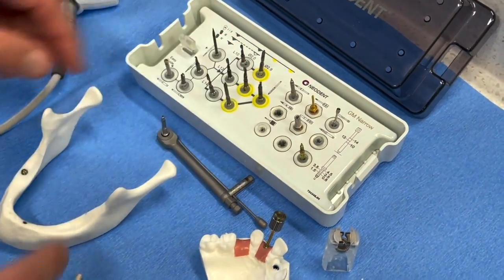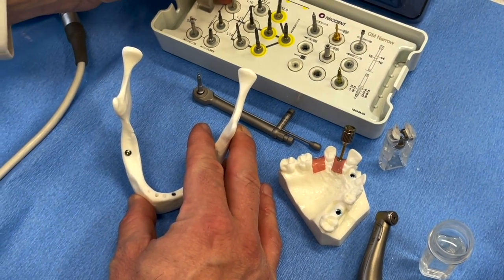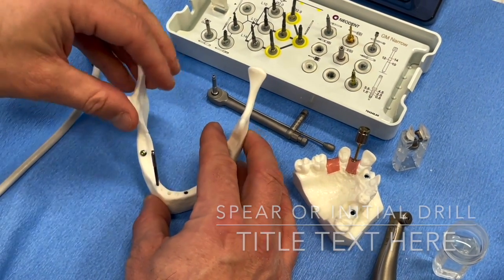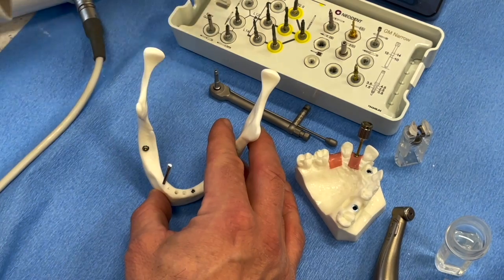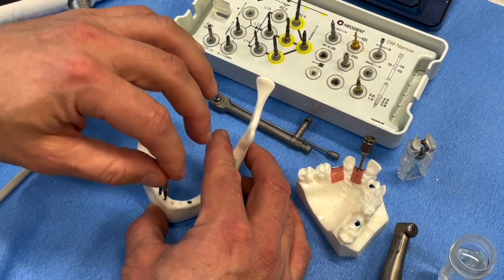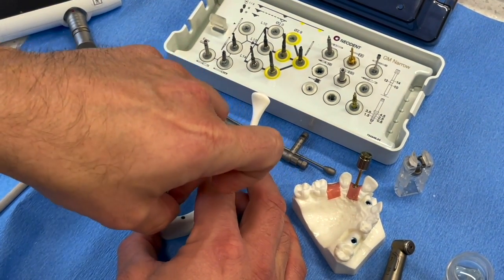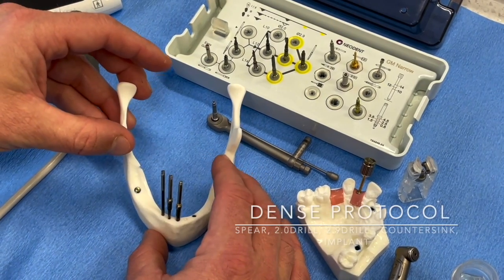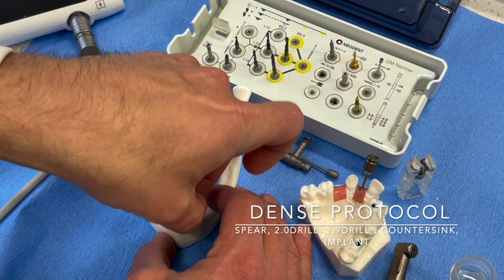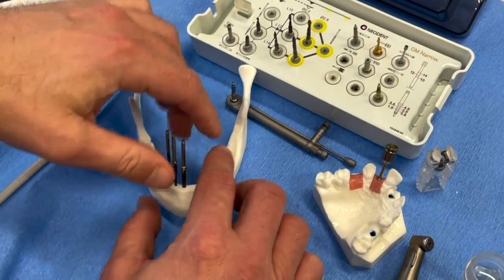For the drilling sequence done conventionally: start with the conventional drill — the spear — as step one. Step two is the 2mm drill. Step three, if we're in soft bone, go straight to the 2.9 undersized drill and place the implant. If it's really dense bone, use the countersink first, then place the implant.